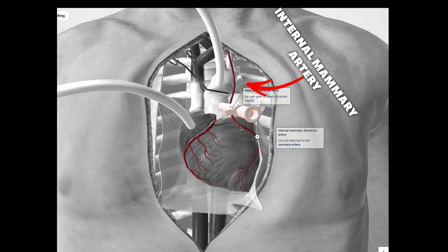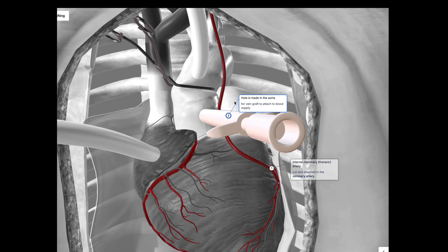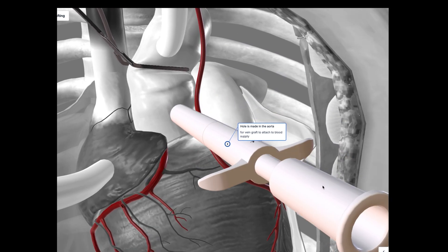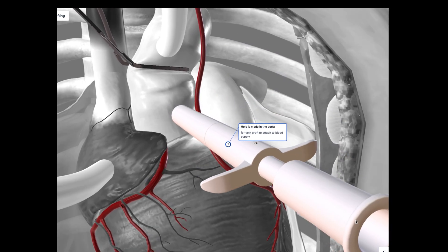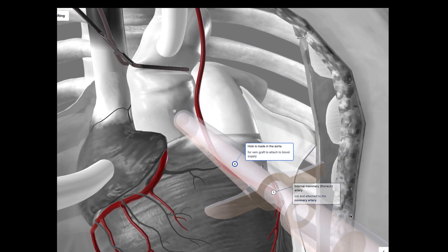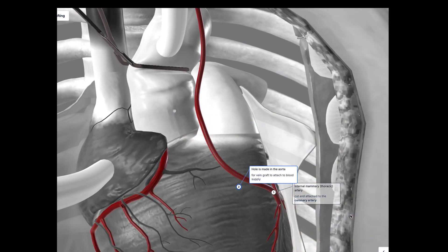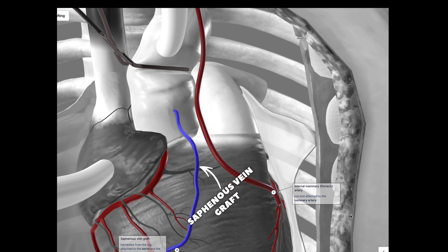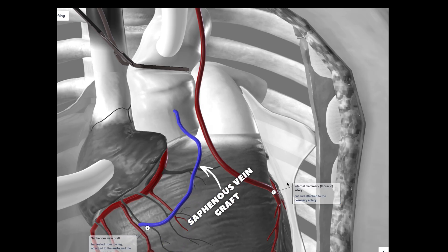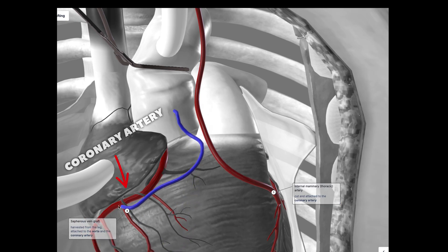During CABG surgery, the internal mammary thoracic artery and saphenous vein graft are attached to the affected coronary arteries below the area of plaque buildup and blockage. Multiple blocked arteries can be bypassed during the same surgery.